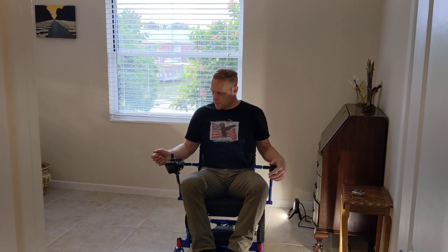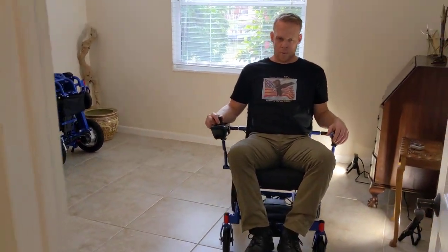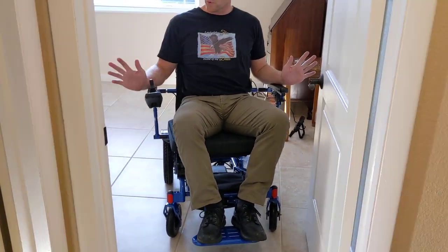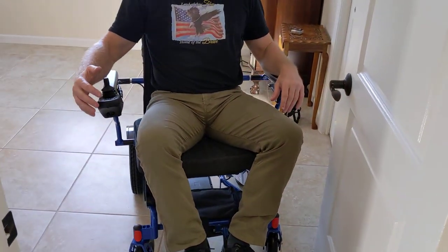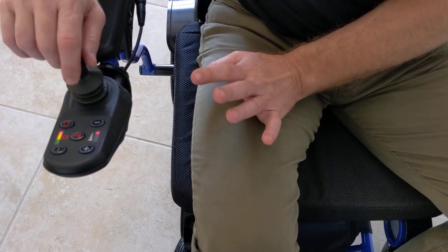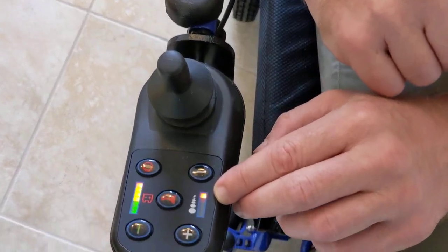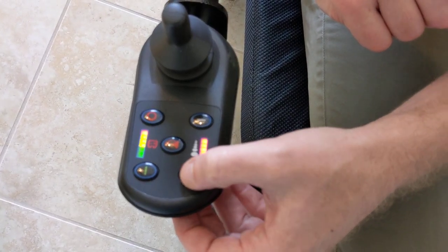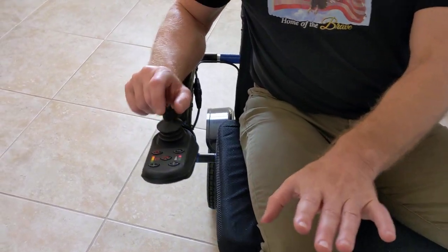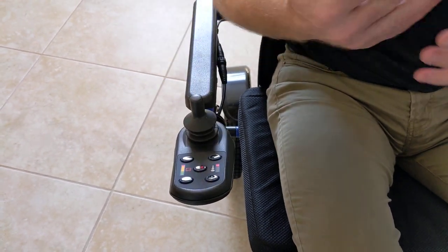The first step always is to turn the speed all the way down. Now notice my technique with the joystick — I can let the chair click by taking my hand off the joystick. The joystick is pressure sensitive, so if I have it all the way back or all the way forward, it's going to go full speed to the capacity of whatever speed adjustment I have. I'm using the slowest speed here, so I can go slower within a slow speed to more easily navigate through a tight situation, because I don't want to chew the armrests up and I don't want to chew my knuckles up.